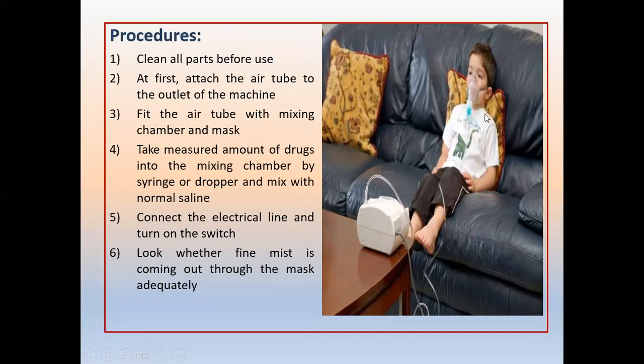The child sits in position with the face mask fitted snugly; that is the nebulizing tube connected to the machine. The machine delivers high-pressure airflow, which vaporizes the substance, carrying non-medical room air along with the medication into the patient with each respiration.